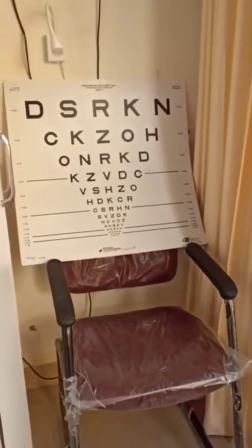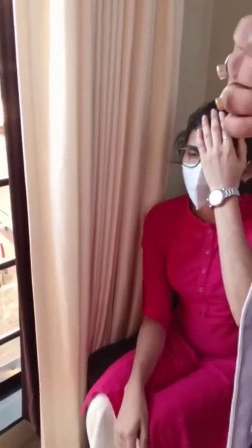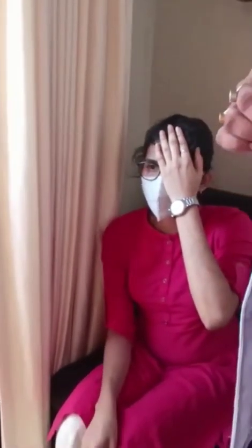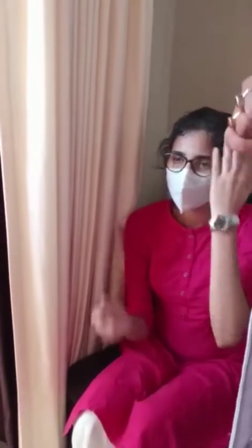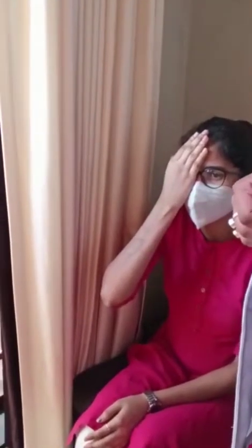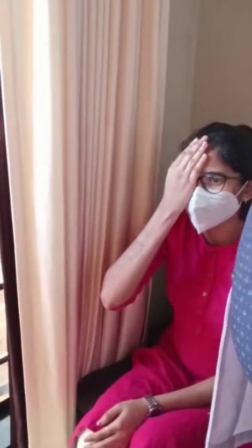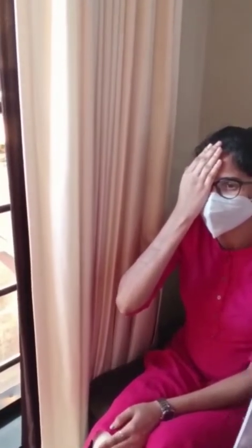S, R, K, N, C, A. Next. A bit blurry. Okay, now check the other eye. B, S, R, K, N, C, K, Z, O, H, O, N, R, K, D. Next. You can't do it.